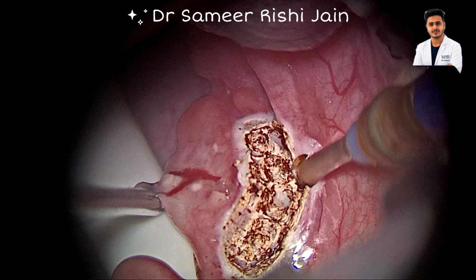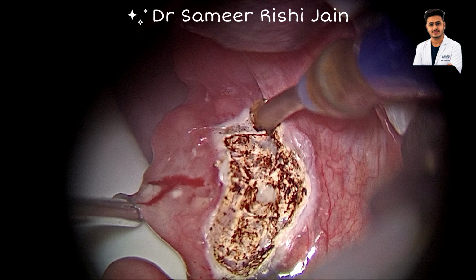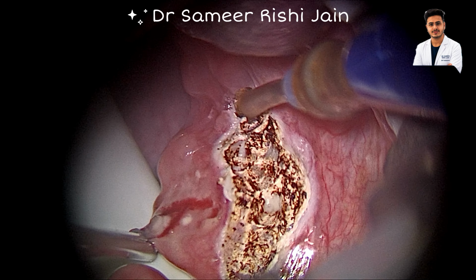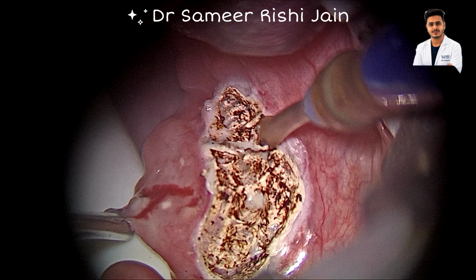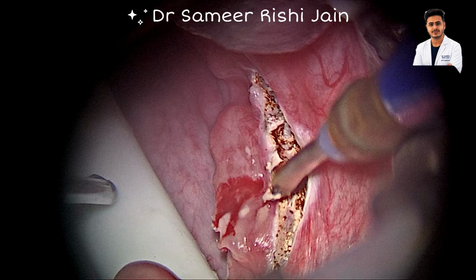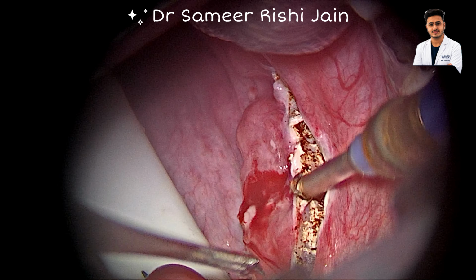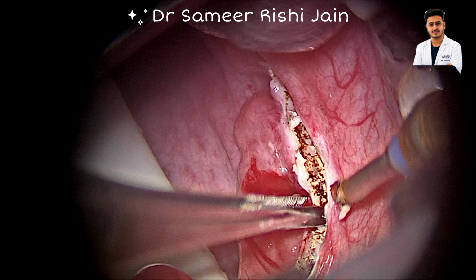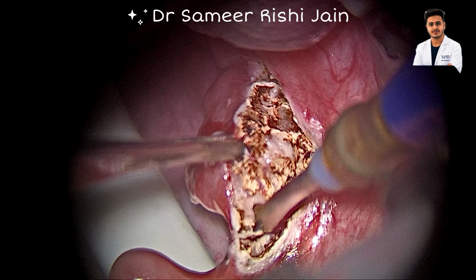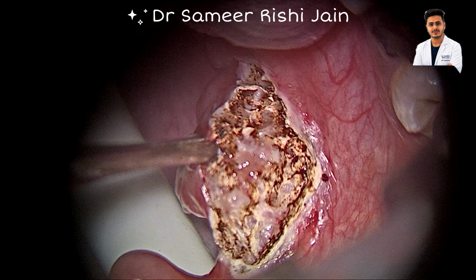If you are having difficulty finding the plane, try to extend your incision a little bit more lateral to the anterior pillar. Here I am extending my incision towards the lower border so that I can find the plane in the lower part of the tonsil, and I will follow that plane up towards the upper pole. You have to give good traction and counter traction so that the difference in the tissue becomes more apparent.